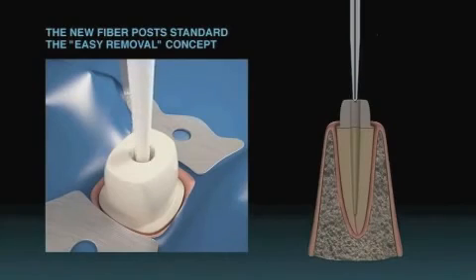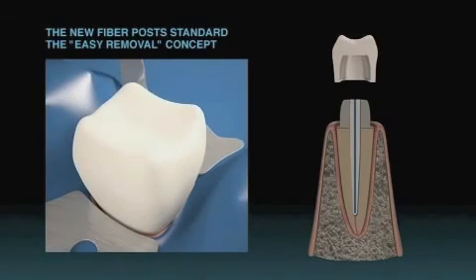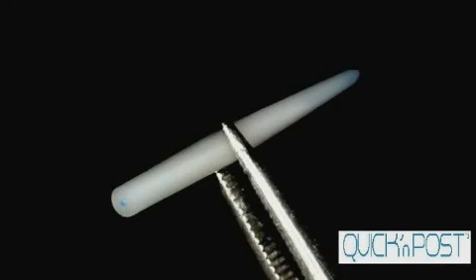When the retreatment is complete and the pathological problem is resolved, a new dental reconstruction can be undertaken, with the certainty that only what was necessary has been removed in order to insert the new post. An ER post, naturally.